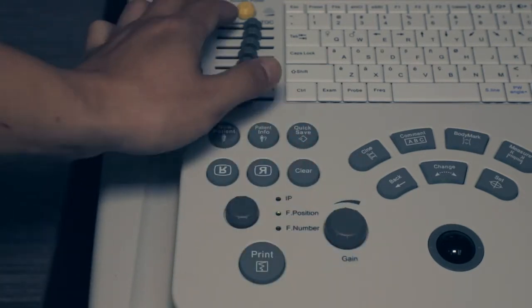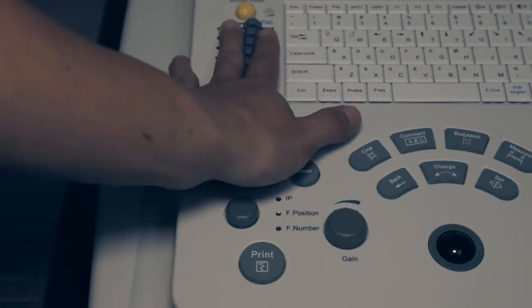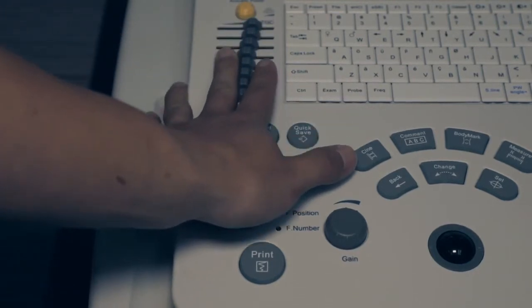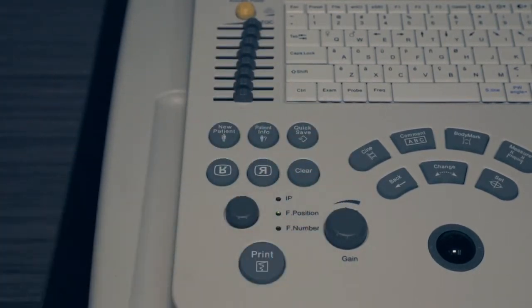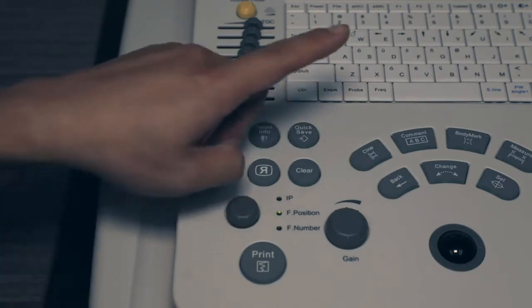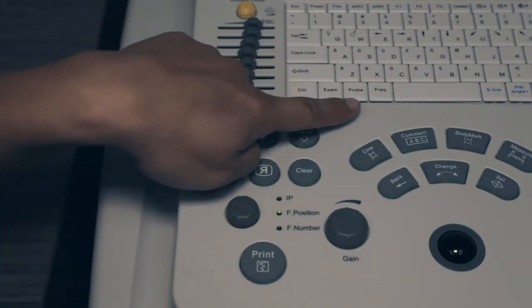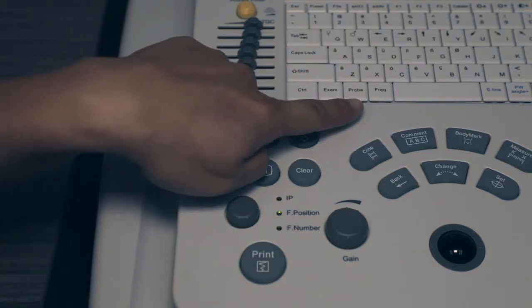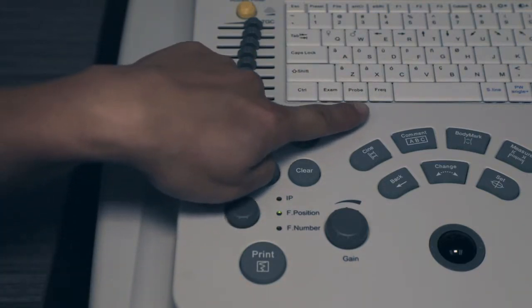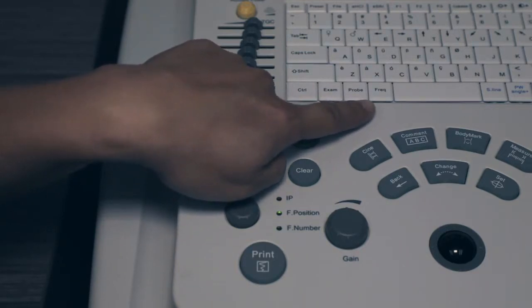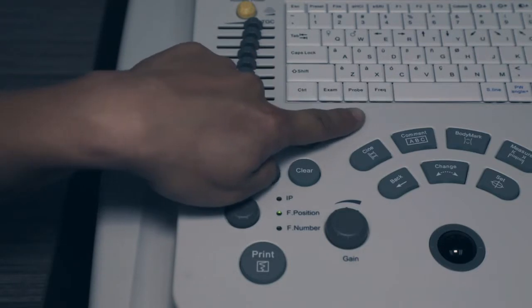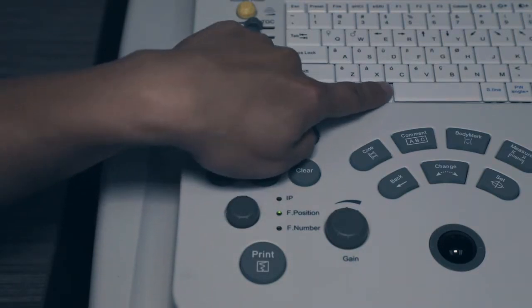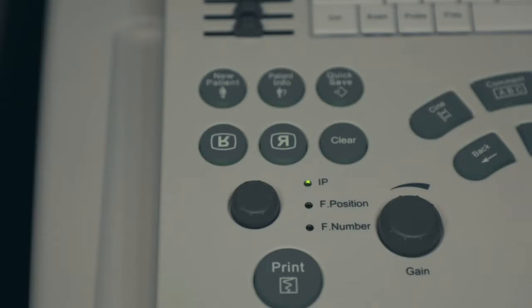Then adjust TGCs from top to bottom. The goal is to keep uniformity of brightness. Frequency: high frequency is high resolution, low penetration; low frequency is low resolution, high penetration. To change frequency, press frequency key. Next, adjust focal point.